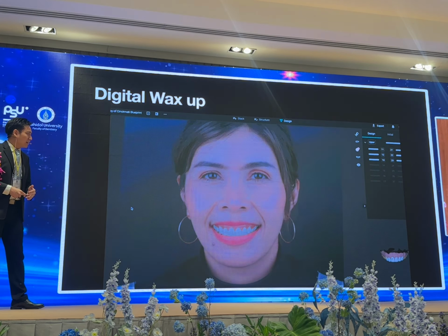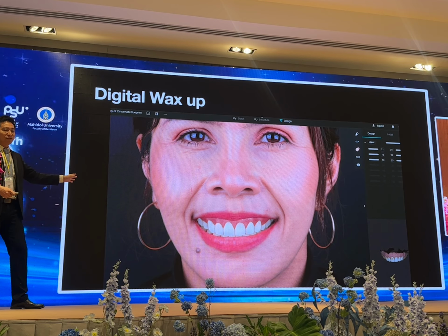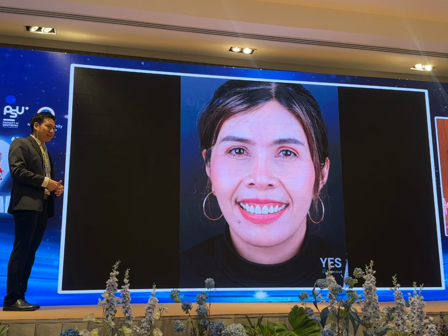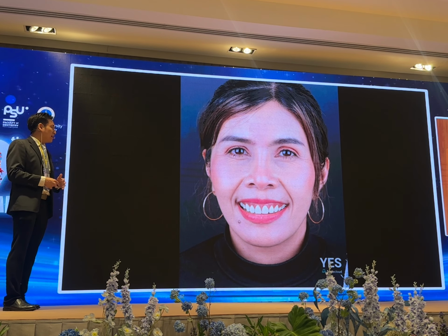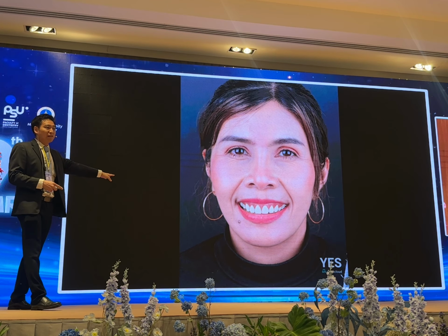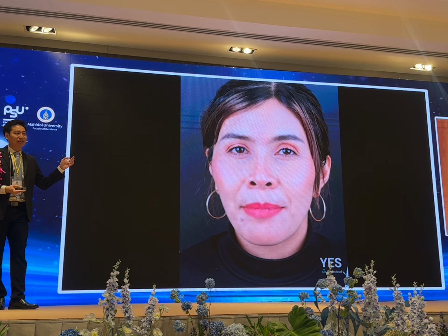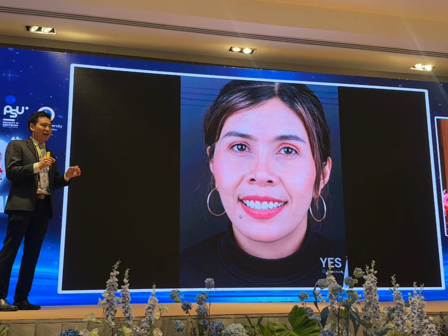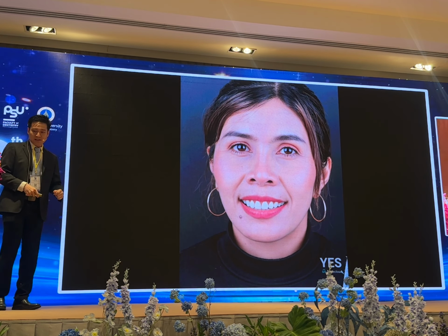Not only that, the technology right now not only creates a blueprint for your final restoration, it can also generate how it's going to look in the patient's mouth. This one is computer generated from a 2D picture, but they can make it look like the patient is speaking. This is AI generated speaking of the patient. So we can see roughly how it's going to look when the patient talks and smiles.